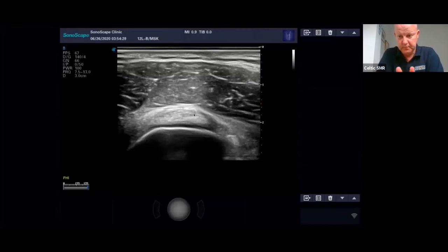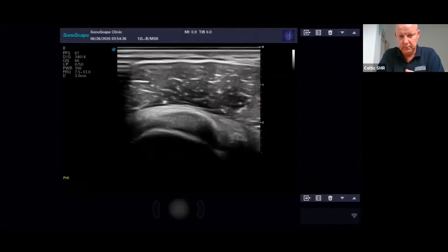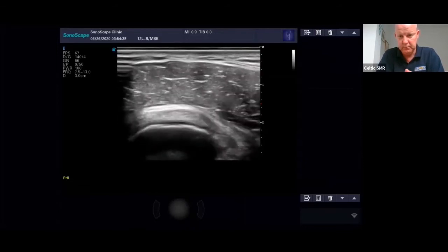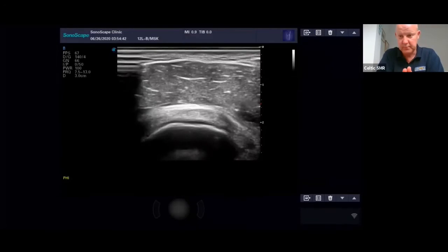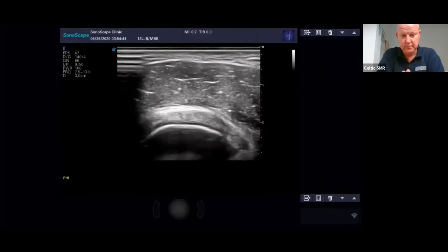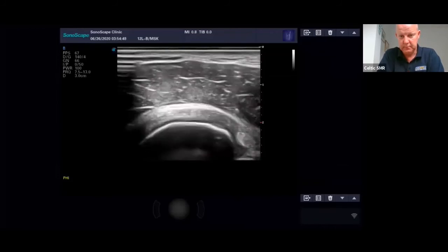So it's a good idea just to make sure that you're not looking at a really thickened echogenic bursa, because obviously that can mimic a tendon, and you can do that just by dynamically moving, and just seeing it and squashing and things like that. So always use your machine to its best advantage. Manipulate your controls, alter your focus, alter your depth. Always keep manipulating your machine to get the best image.